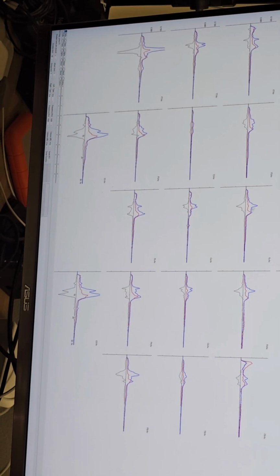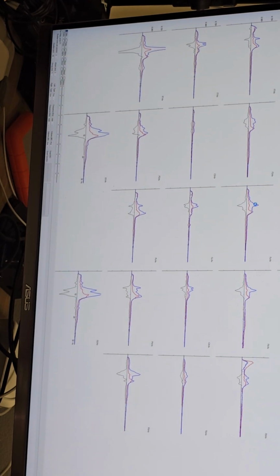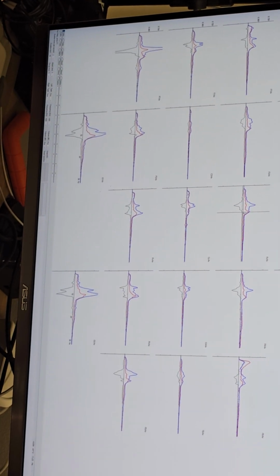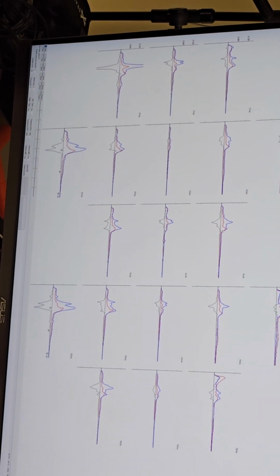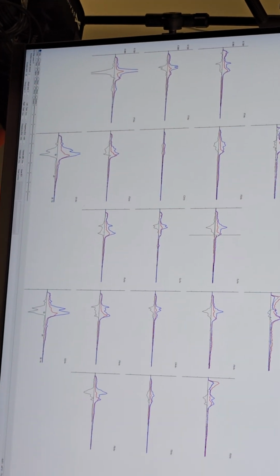Now your brain is actually already looking a lot better than this looks. My brain still has a lot of frontal theta, and yours isn't showing that at all. So that's good.